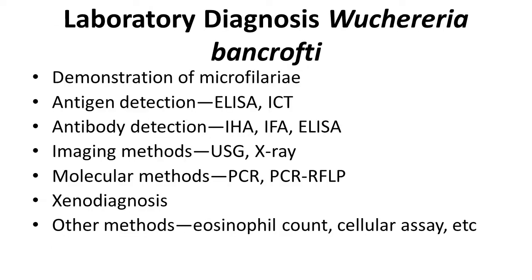Next one, laboratory diagnosis of Wuchereria bancrofti. Wuchereria bancrofti is the common tissue nematode present in Sri Lanka. The next one is Brugia malayi. So we have to differentiate these two, Wuchereria and Brugia malayi.